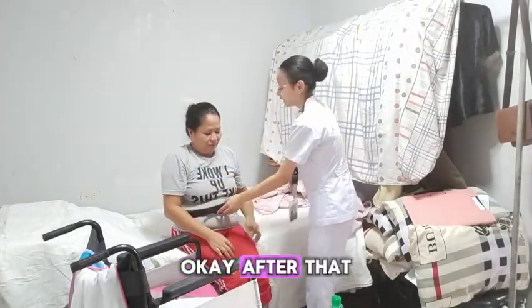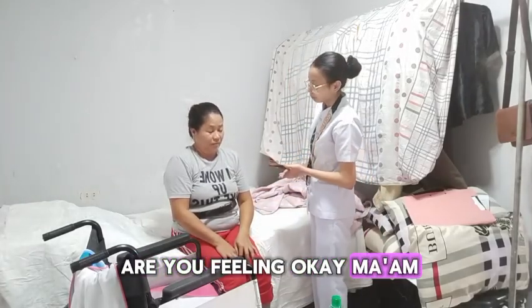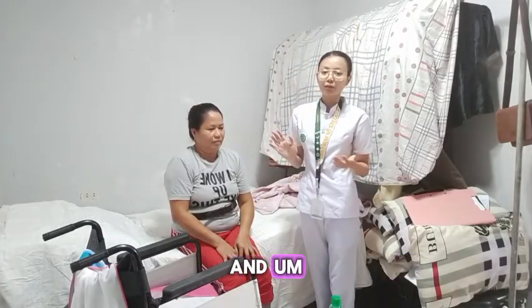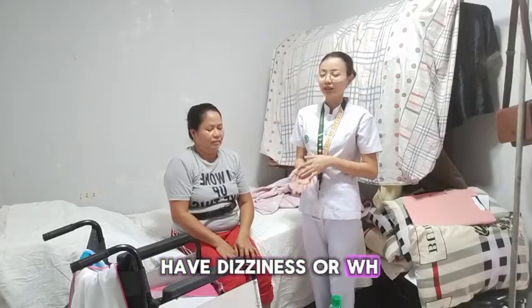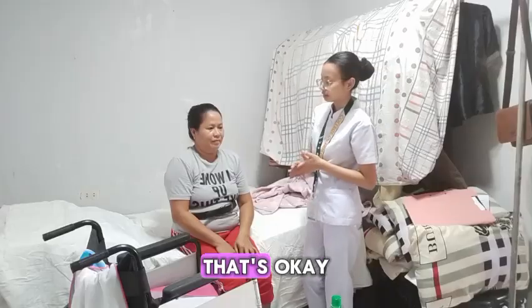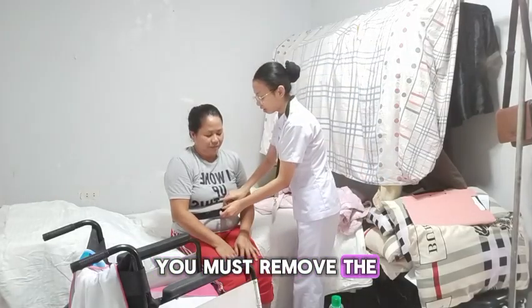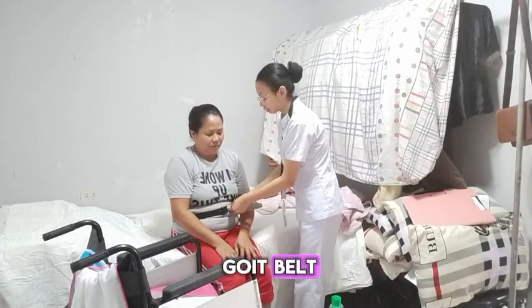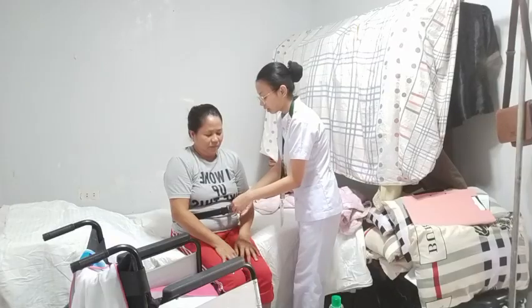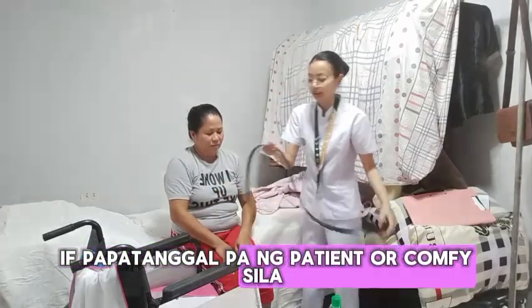Okay. After that, let the patient rest again. Are you feeling okay, ma'am? And ask them if they have dizziness. Are you feeling dizzy? Okay. Fine. Let her rest for a few minutes. After a few minutes of resting, we must remove the gait belt, but it is also optional.